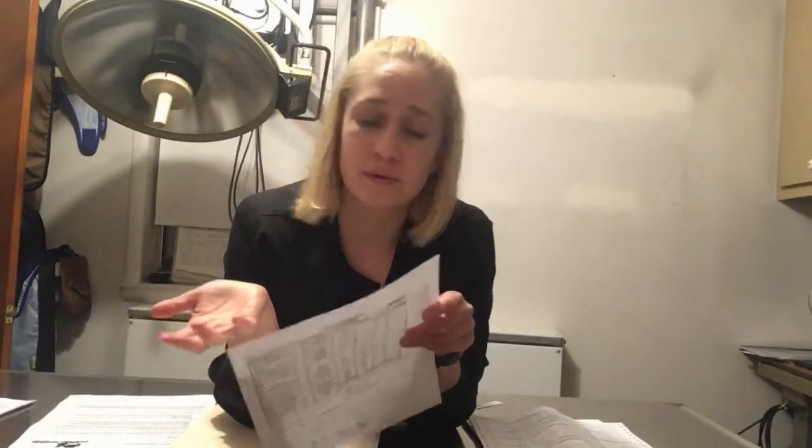And then we will also keep track underneath that. We'll say what procedure it is, who helped out the doctor today, and then we'll fill out the times that the procedure started and anesthesia started, and then Dr. Turner will fill out his procedure notes down at the bottom. And then on the back is, like I said, where we do our anesthesia monitoring. So we have a chart that we will fill out every 5 minutes. We'll have our temperature, heart rate, respiratory rate, SpO2, what ISO percentage they're on, what flow rate they're on, any fluid rate change, or none if that may be the case, and anything else that we want to note as far as our procedure goes.